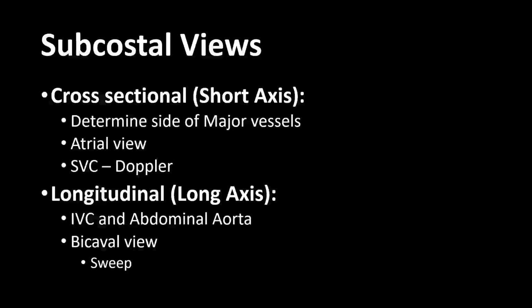And the aorta is towards the right of the pulmonary artery and posterior. And then we sweep the probe from there, keeping the probe orientation marker at 3 o'clock, downwards. Then just below the pulmonary artery, your LA opens up, and in your LA, there are 4 pulmonary veins entering, and this is known as the crab view. So this is your pulmonary vein view. So we have discussed the arch view, ductal view, pulmonary artery view, and the pulmonary vein view. Now we have come down to the subcostal views in the end, because it irritates the baby.